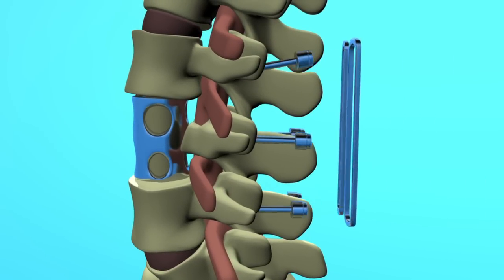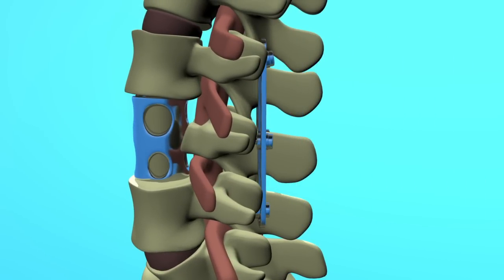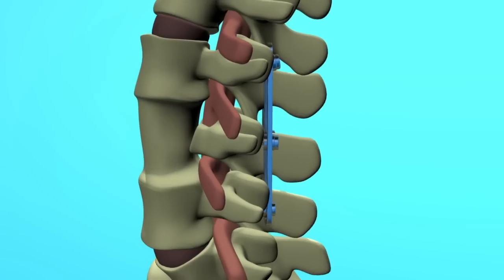Holes are then drilled into the healthy vertebrae, and metal rods are used to help stabilize the VBR as the bone graft grows into place.